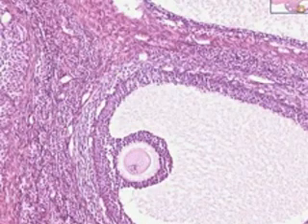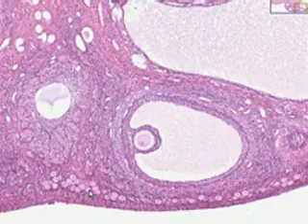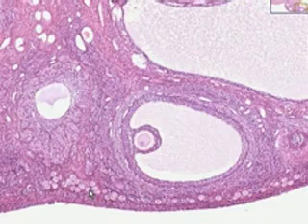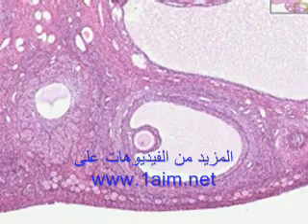So it's not really fair to talk about the ovary unless you talk about the various phases of development of follicles. And as you go from the oocyte to the primordial follicle, to the primary follicle, to the secondary follicle, to the Graafian follicle, you have all diagnostic features which differentiate one from the other. And that's really all I want to say about ovary for now. So I will thank you very much.